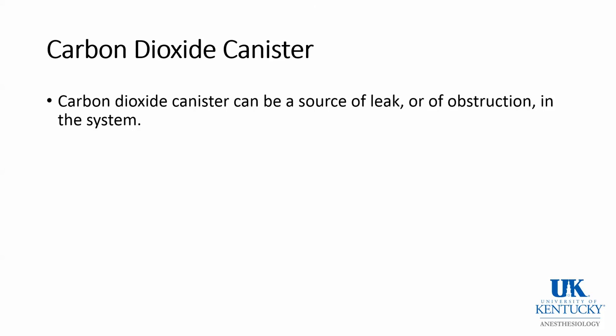The carbon dioxide canister itself can be a source of leak or of obstruction within the system. All sorts of case reports of obstruction or malfunction or channeling have been made and are well documented in the literature.